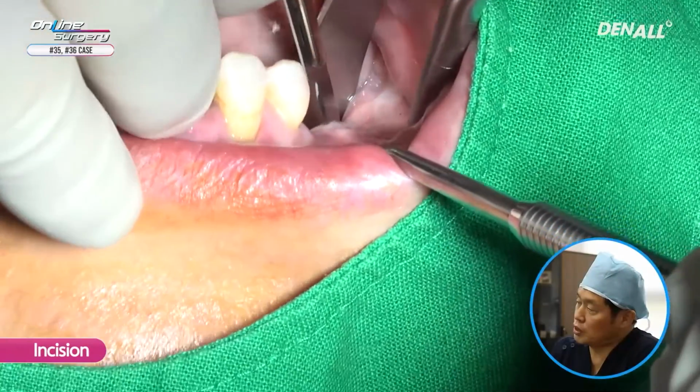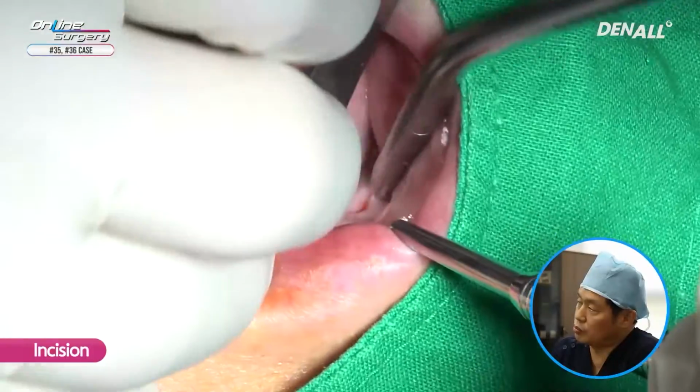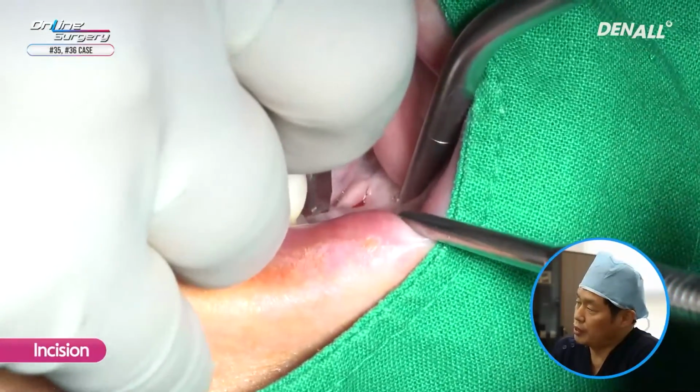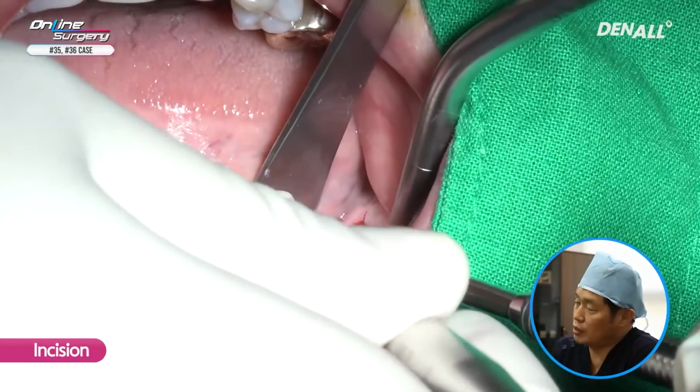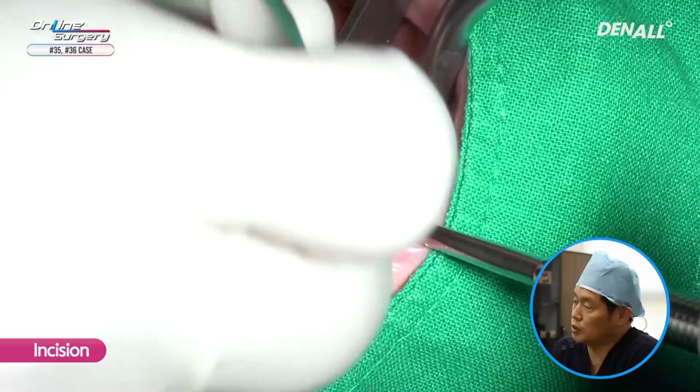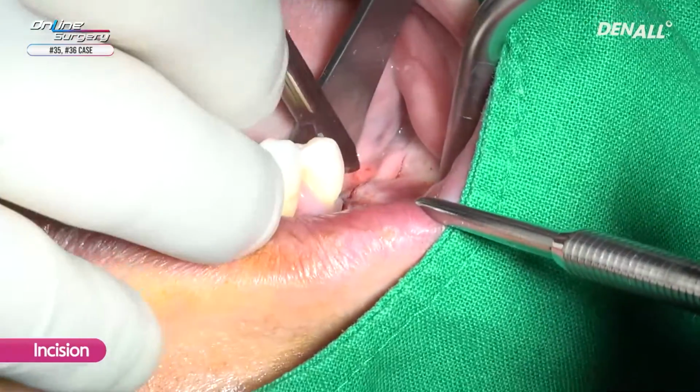There was insufficient attached gingiva and GBR was planned. Although OneGuide will be used, incision was made and surgery was proceeded with slightly reflected flap.